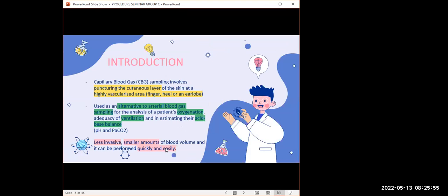One more thing for blood gas: you also need to know what can cause errors in blood gas interpretation, because blood gas always comes up in exams. So you need to know the types of error that can occur. For example, I'll give you one clue: if you have polycythemia, it will affect the reading. How does it affect the reading? And for example, if you don't use ice, what happens? If you shake too much, what happens? Too much heparin, oxygen contamination. These are all the errors that can occur with blood gas analysis, and you have to be aware of this. Okay, next.